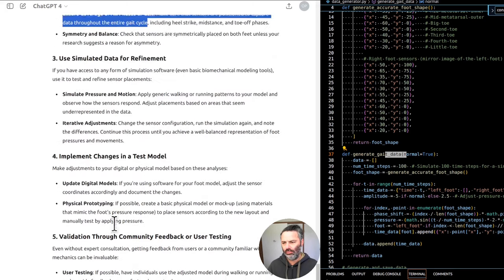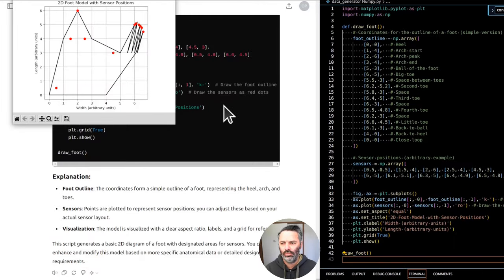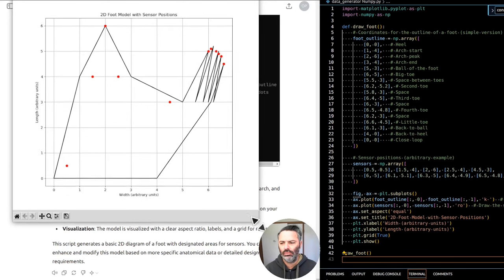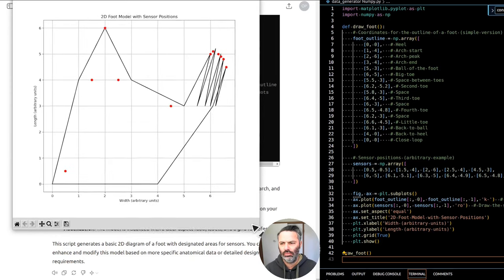Refining the positions of sensors in your foot model without collecting new data or consulting with experts requires a methodical approach based on existing knowledge, literature, and logical adjustments. Iterative adjustments: change the sensor configuration, run the simulation again, and note the differences. Continue this process until you achieve a well-balanced representation of foot pressures and movements.